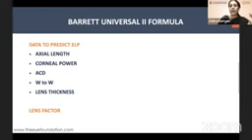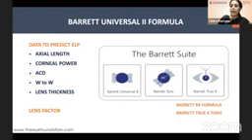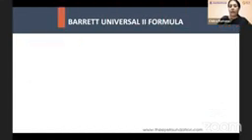We need to know that these are based on thick lens formulae, and what it does is it is able to tell you exactly what is the position of the IOL in the bag, that is the lens factor. It tells you about the different changes in the effective lens position based on the different principal planes of the IOL. It tells you whether you need to place a with-the-rule IOL astigmatism or you're dealing with against-the-rule astigmatism. It tells you whether you're going to use a Barrett True-K formula, and it uses double-K solutions. In other words, the Barrett Suite seems to give you a convincing answer for a routine situation for a toric IOL implant and a post-refractive surgery eye.